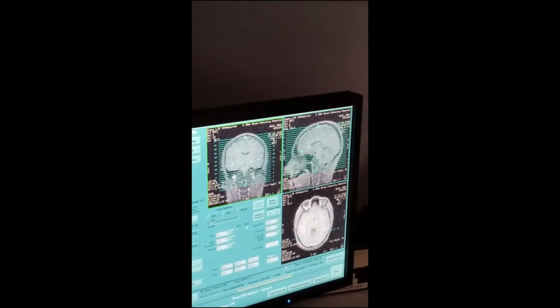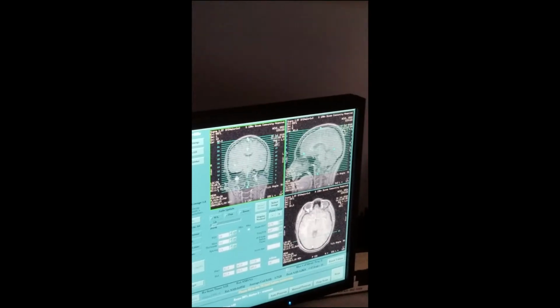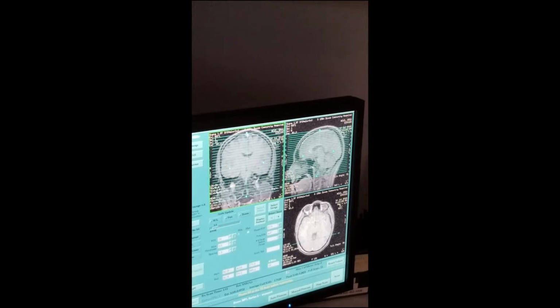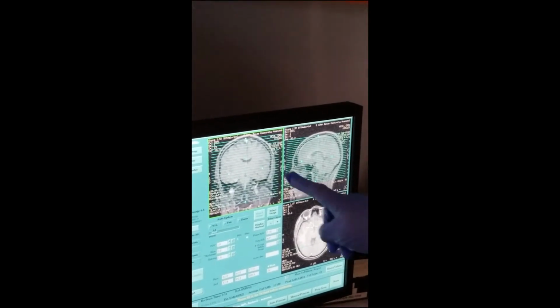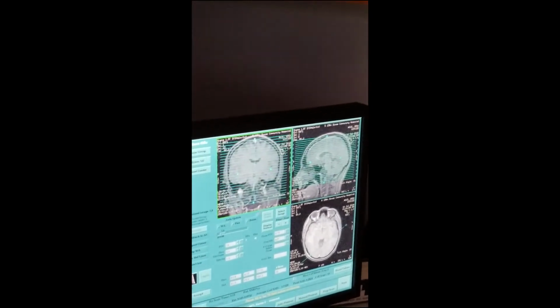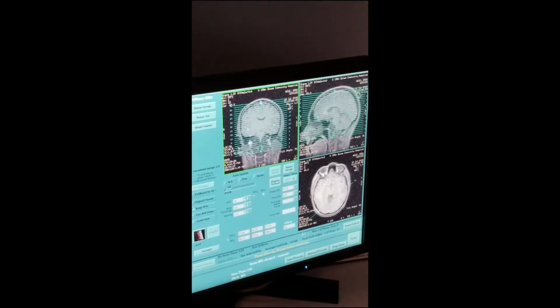Right there. You see how we center over the ventricle? Yes. You can do a slight 1 millimeter tilt if you want. Tilt is just a millimeter, it's not adding slices. Perfect. So that's good. If you're done, what do we do? Accept.